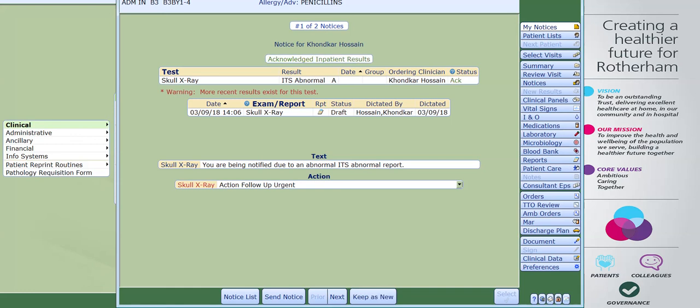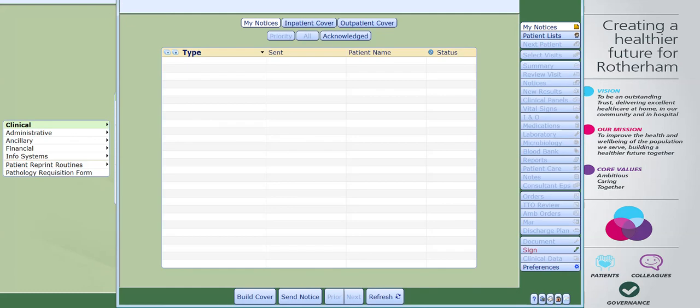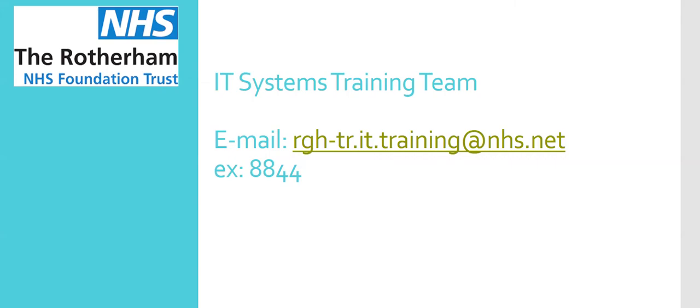Repeat this process for however many results you need to view and action. Clicking onto the next button will take you onto the next patient within your list; alternatively, clicking onto notice list will take you back to your my notices section. And that's it. If you need any further guidance, please contact a member of the IT systems training team — the details are on your screen now. Thank you.